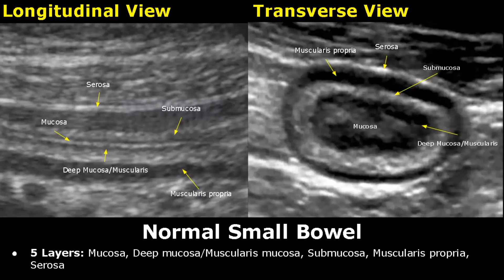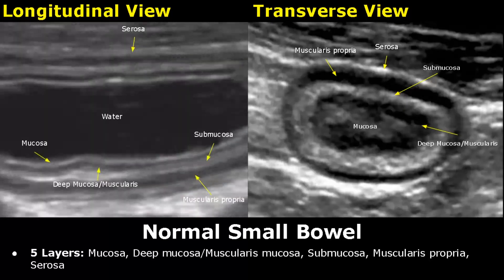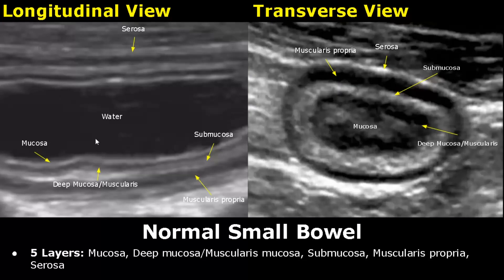We may not always see all five layers, as they can be compressed by the probe, the nearby mesenteric fat, or if they are filled with fluid or intraluminal contents. Here is a water-filled stomach. The stomach and the intestines layers have the same appearance on ultrasound.